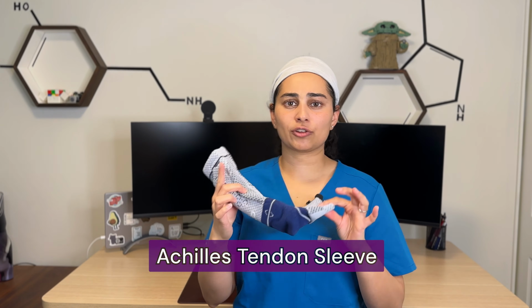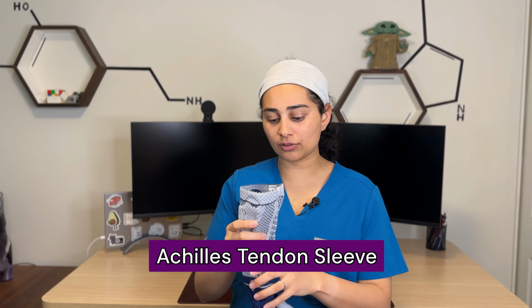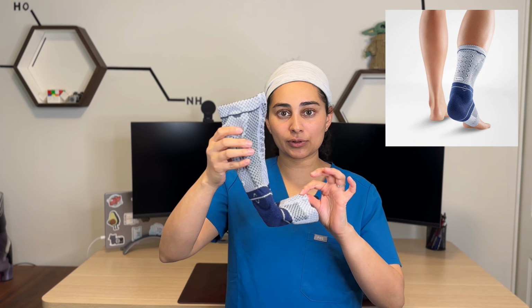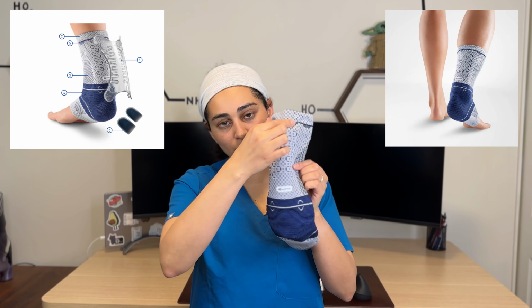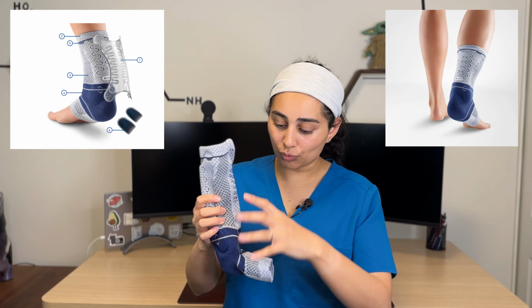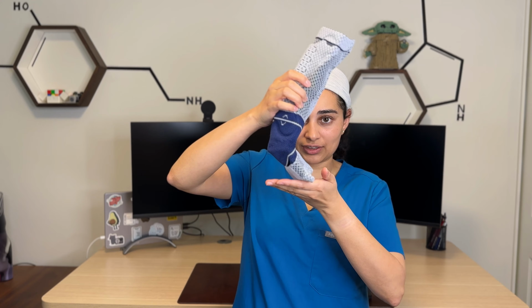This here is actually a specialized Achilles tendon sleeve. It's not something I commonly recommend, but it's one that was available to me that I wanted to show you. What this does is it stabilizes the ankle joint, but it also provides a lot of stability along the Achilles here. And this is given with heel cups, because when the Achilles tendon is really sore, you want to lift the heel slightly to help shorten the tendon, to take off load from the tendon, to decrease symptoms and allow it to heal.